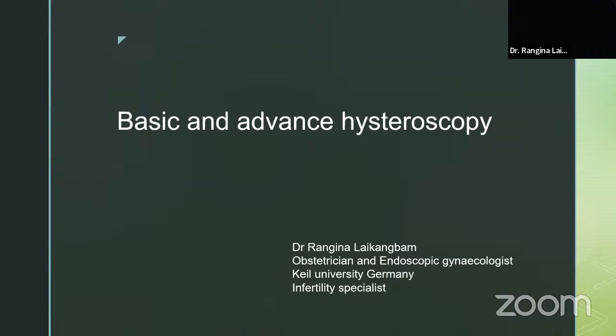Apart from that, the preoperative preparation should be done nicely, like at least 8 hours of NPO, and preoperative insertion of misoprostol. Sometimes in cervical stenosis, even in nullipara, it's very difficult to insert the scope. So misoprostol preparation will help in dilatation of the cervix. This preoperative preparation is very important.